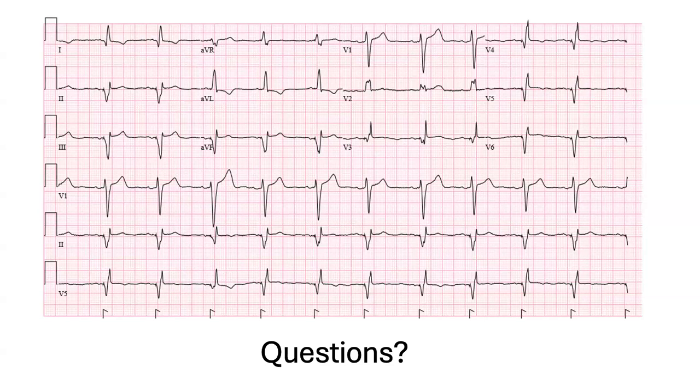So, from this explanation you gave, if a patient can't get a left ventricular lead in, and there is an option for left bundle area pacing, you put an ICD lead separately and the left bundle pacing separately. Is that what you just said, ma'am?